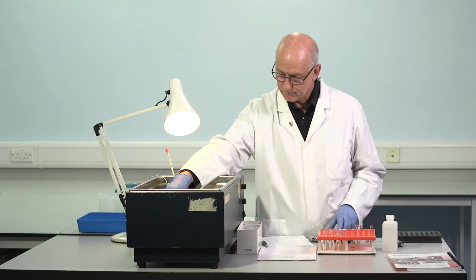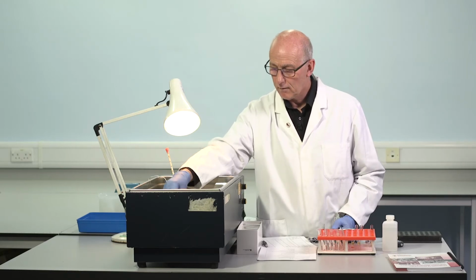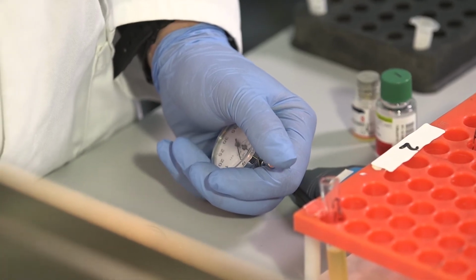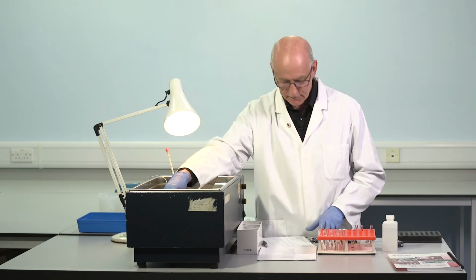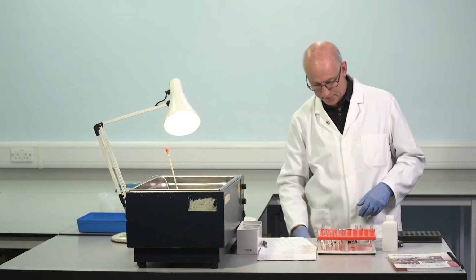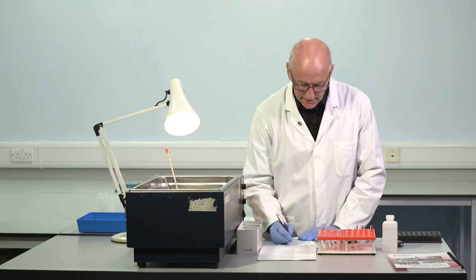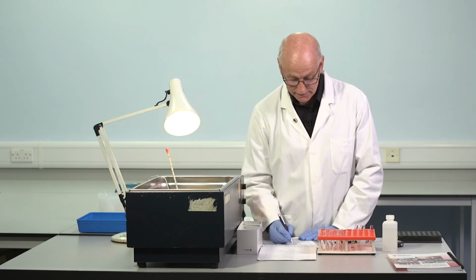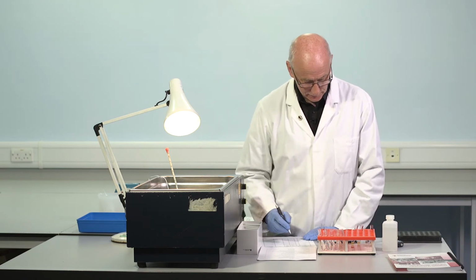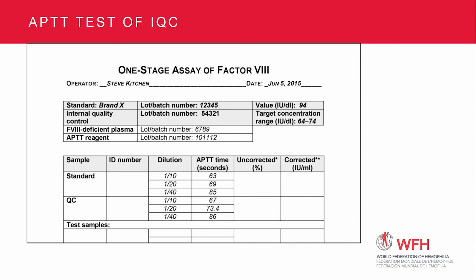First tube clotted. Second tube clotted. Third tube clotted. Excuse me. So 1 in 10, 1 in 20, 1 in 40 dilution. 1 in 10 dilution, 67 seconds. 1 in 20 dilution, 73 seconds. Third tube, 86 seconds.